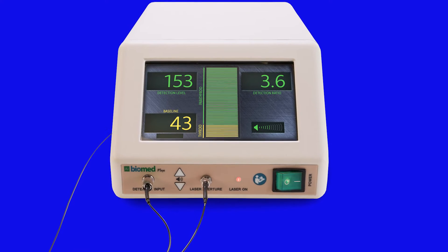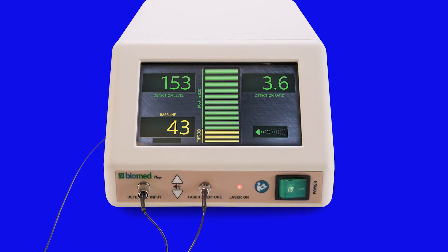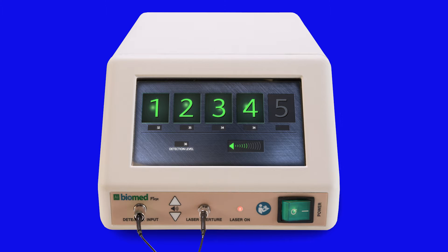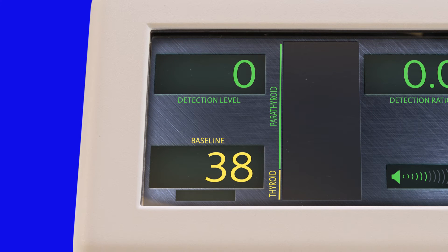Before you can use the device to detect parathyroid tissue, you must collect baseline data for the thyroid. Collecting baseline data is done by placing the probe tip gently on thyroid tissue and pressing the foot pedal. This captures the first data point. Repeat at four additional unique locations on thyroid tissue. The system provides both audible and visual feedback to confirm baseline is established. Once you have collected the five baseline points, the system calculates the median of the five points to establish a baseline for the thyroid detection levels.